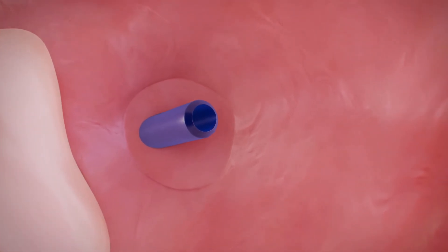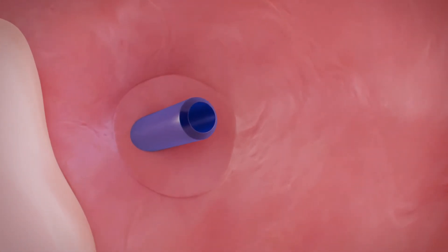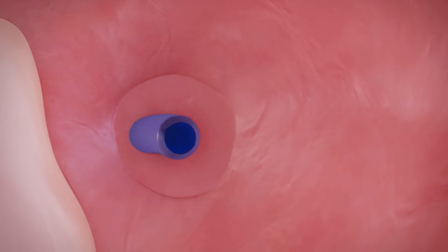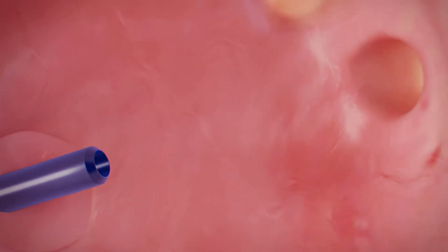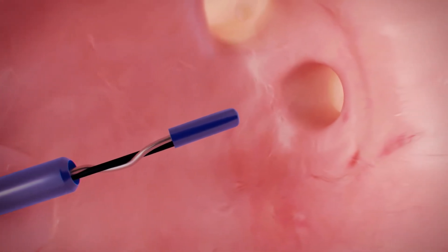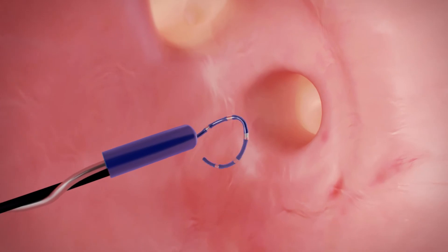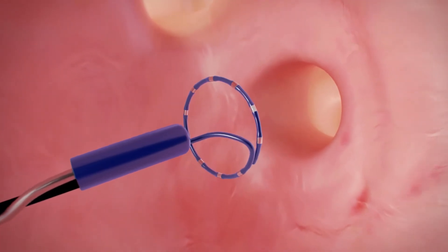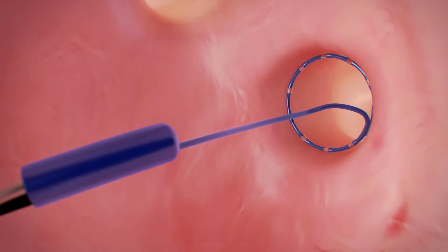The catheter system is inserted into the left atrium via a transseptal puncture. The steerable sheath ensures excellent maneuverability. Cool Loop is guided through the sheath up to the pulmonary vein and positioned by the use of an inner lumen mapping catheter. Electrical signals are assessed.